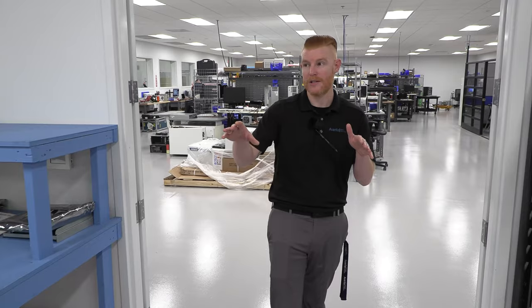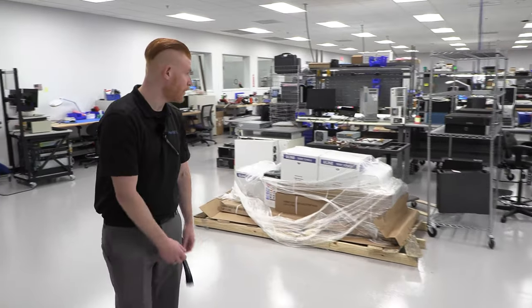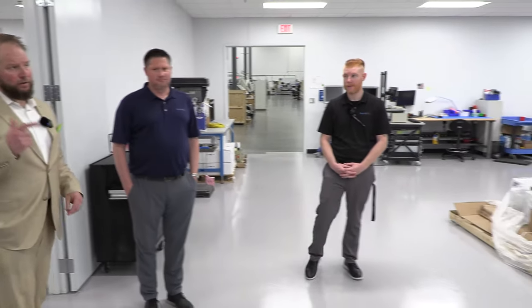So when that happens, that process gets transferred to my repair team next door. These guys are the ones that come up with how things are going to get repaired. That's correct. Of course, as ISO 13485, those quality standards and work instructions have to be written. So after they figure out what to do, they'll write it out so the folks next door can do it. Additionally, they'll develop service strategies for our engineers in the field, as well as training curriculum for both internal and external customers.